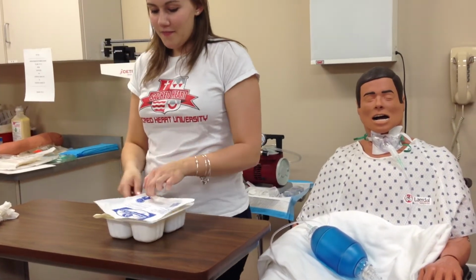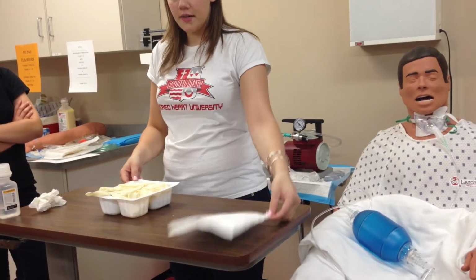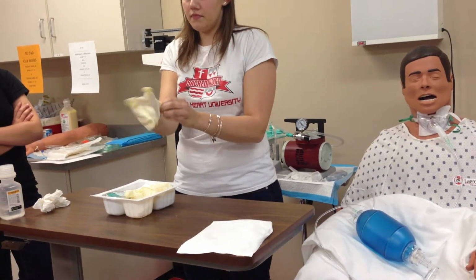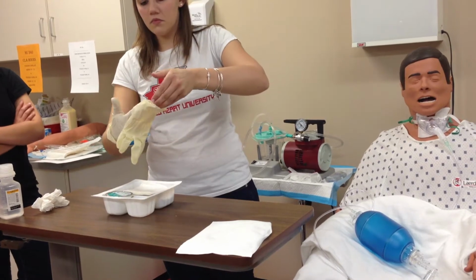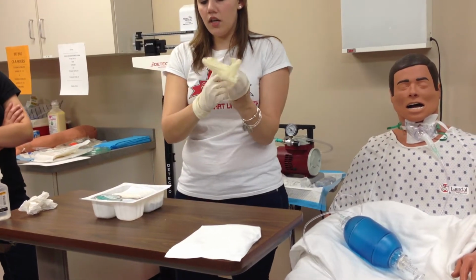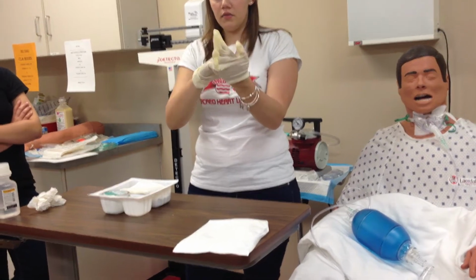That happened during sim. Okay, so this, same thing, this is sterile. So you're going to open this up. Your gloves should be on top. And you will get to use nice new kits, so the gloves will be in there the right way.